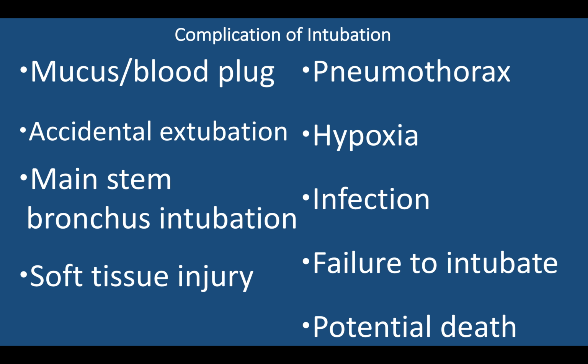A pneumothorax, while not too common, is still a problem that we come across with intubations, especially with people who are over-aggressively bagging the patients. Please remember to bag calmly, even though it is a scary situation. Hypoxia may occur right after intubation. Continue to bag the patient as long as you know you're in the correct position. Make sure your oxygen is on.